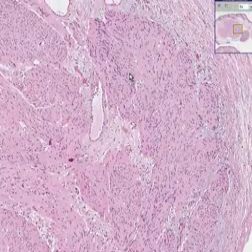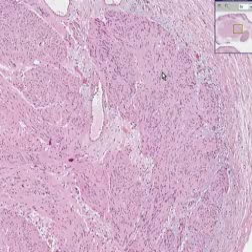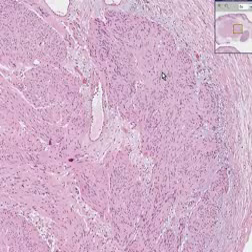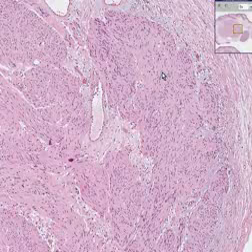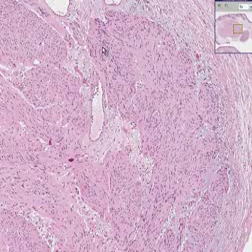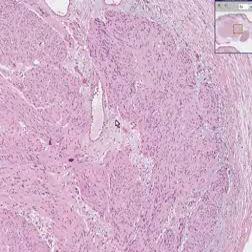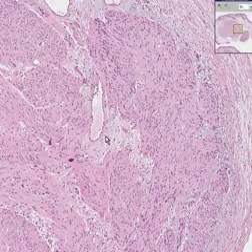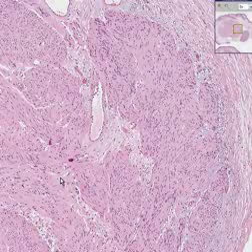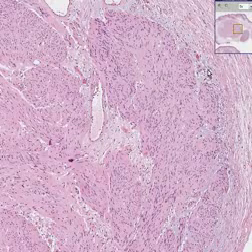Schwannomas classically have two areas. And I don't know why they called it this, but it's kind of stupid and it doesn't matter. But I'll tell you what they are anyway, because you'll hear them. They're called Antoni A and Antoni B. The Antoni A areas are areas in which the neural spindly cells stand up in a palisaded fashion. And you're getting kind of an appreciation for that along here, aren't you? And the Antoni B areas are areas where the tumor cells perhaps have a lot of edema or a much looser type of connective tissue, like here, like here, like here, and like here.